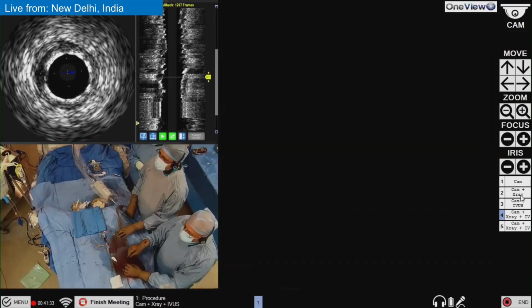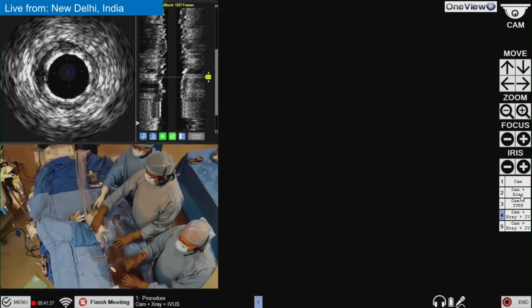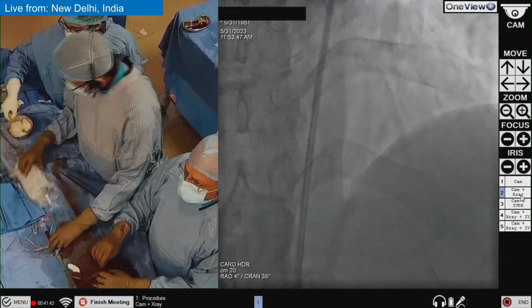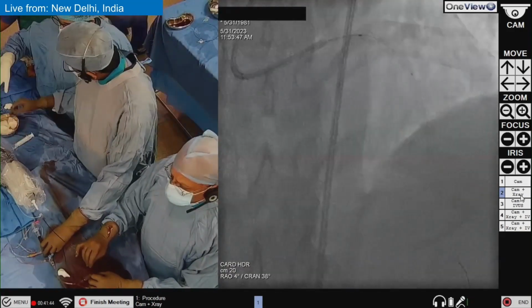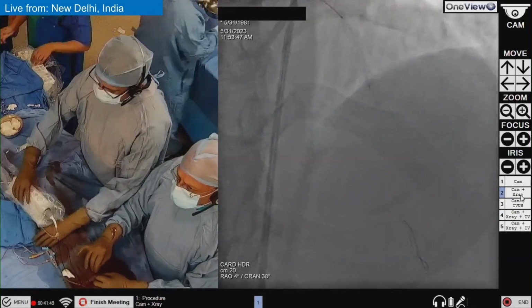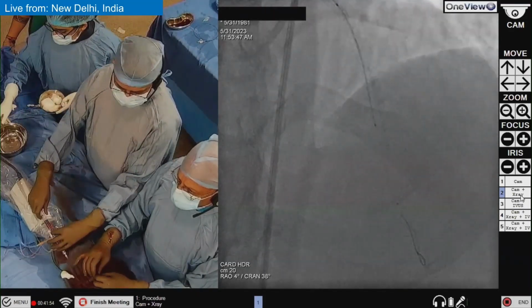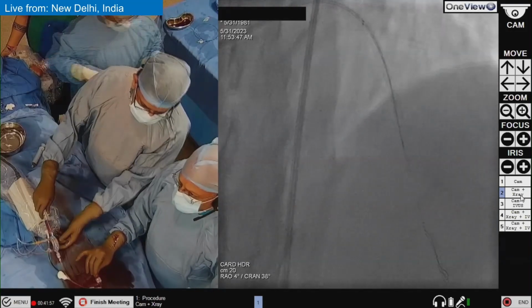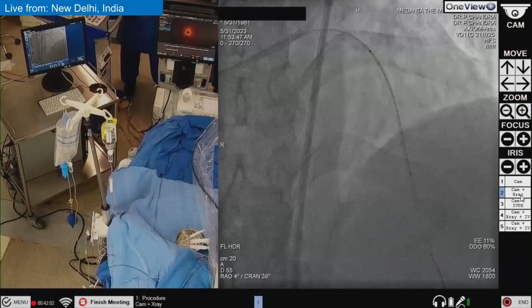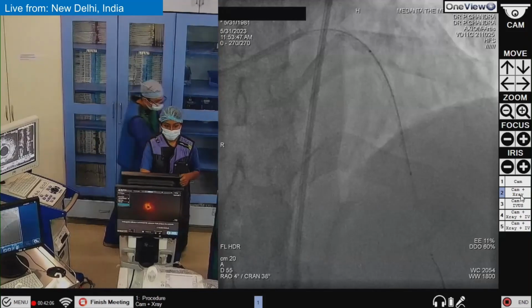Now bring it forward. Okay. So this is our OCT. Bring it forward. So what are the settings? Settings are survey 75 and the catheter looks good.